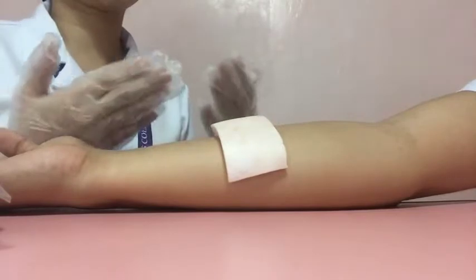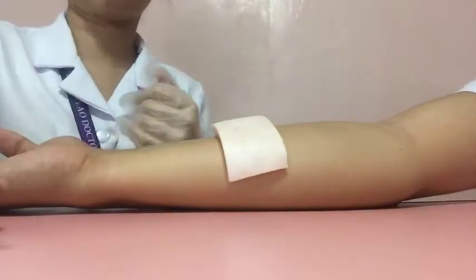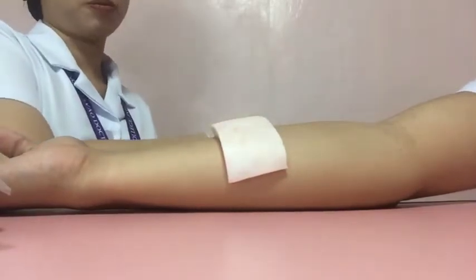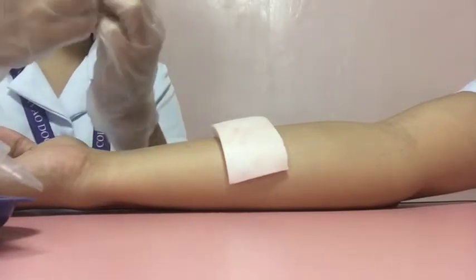So now let's cleanse the skin at the site using a firm circular motion and ask permission before doing so. So ma'am, hahawakan na kita ma'am ha. Sige, ma'am.